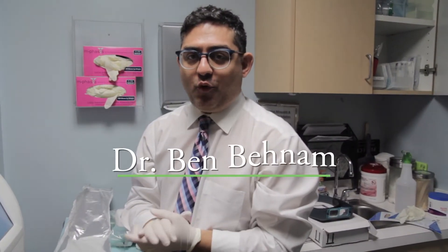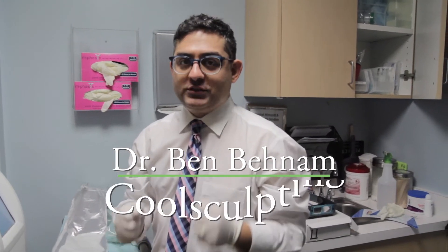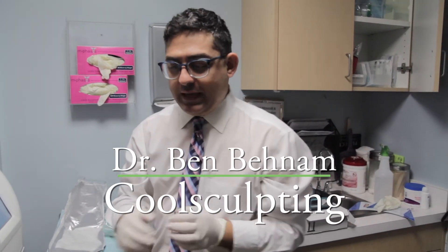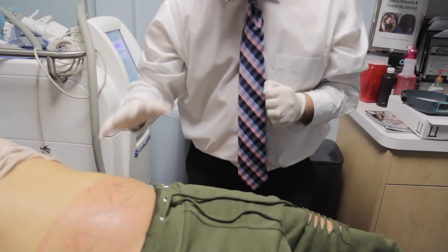Good morning, this is Dr. Ben Benham. I'm a board-certified dermatologist. Today we have another lovely patient that we're going to do CoolSculpting on. We have already done one side, so the most common area where we do CoolSculpting is the lower abdomen.